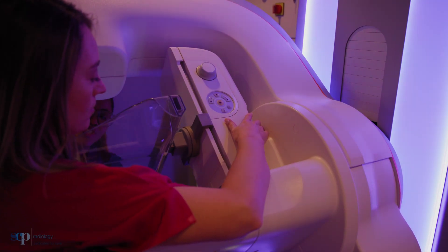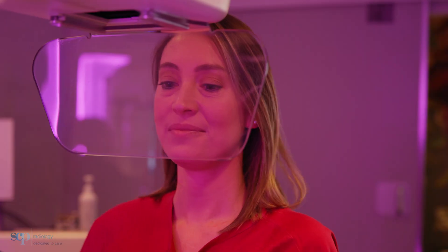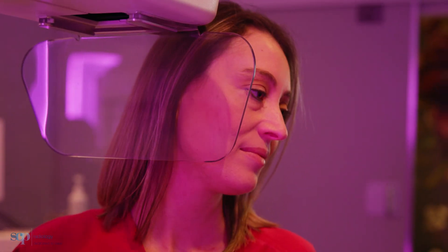In diagnostic mammography, we would want to confirm the presence of the palpable lump and then also to better define the nature of the lump. Sometimes a palpable lump can turn out to be a simple cyst — in that case, we will reassure the patient and tell her not to worry. Occasionally, the palpable lump is something that looks really benign and was there before when we compare it to the previous mammogram. In that case, we can also reassure the patient or suggest a follow-up ultrasound in six months.